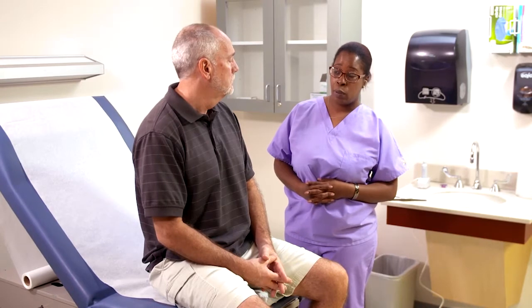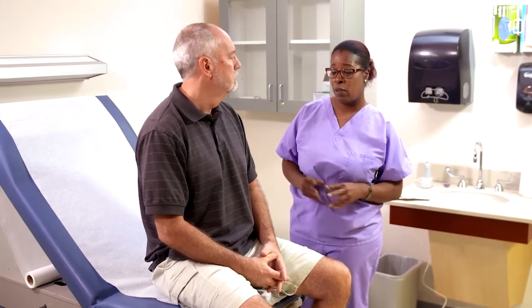Dr. Smith would like for me to give you an electrocardiograph today, so that's going to show the heart activity. I will be placing a total of 10 electrodes on you — on your chest, your arms, and your legs. Do you have any questions? Is this going to shock me? No, it will not shock you. It will just be the information or activity from your body to the machine.